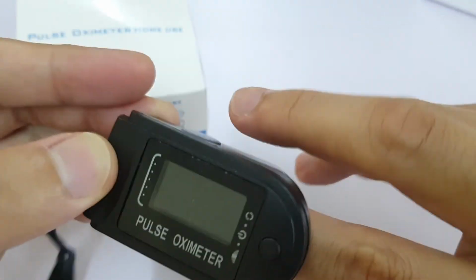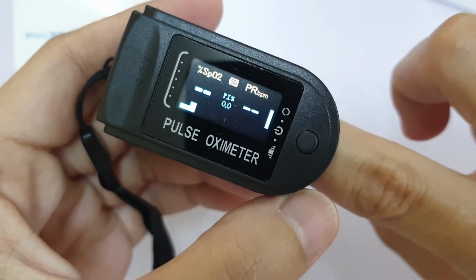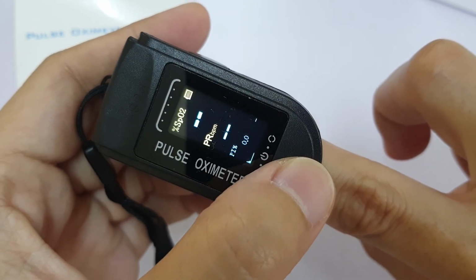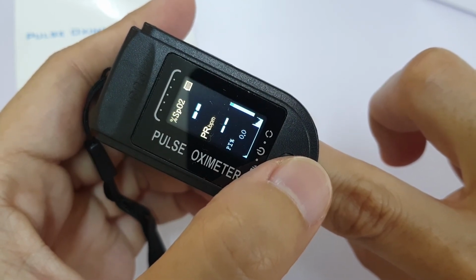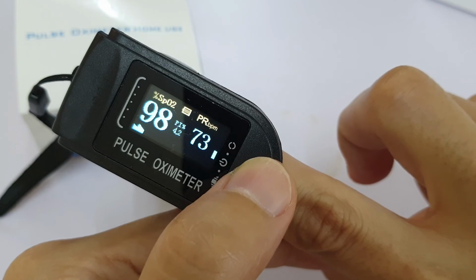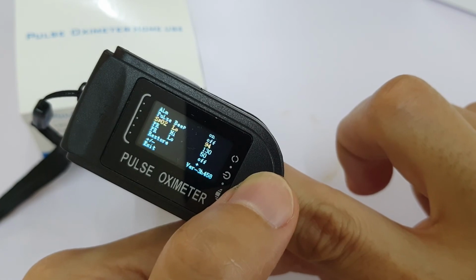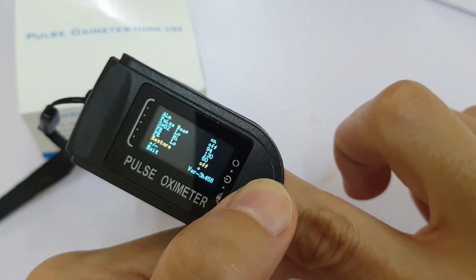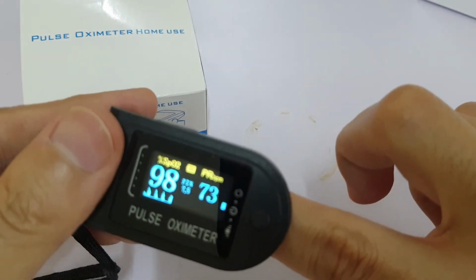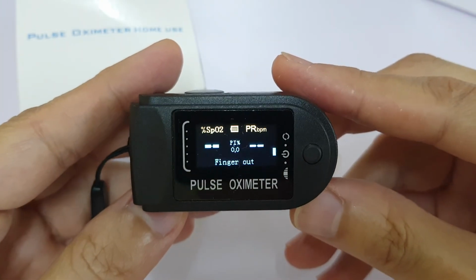Okay, and then how do you use it? You just put it on your finger and then turn it on. It will start measurement. If you click once, it rotates the display. If you click and hold, it goes into configuration. You can configure levels and alarms. Hold to exit. So this is a quick look at a small home-based pulse oximeter. Very useful, very important.